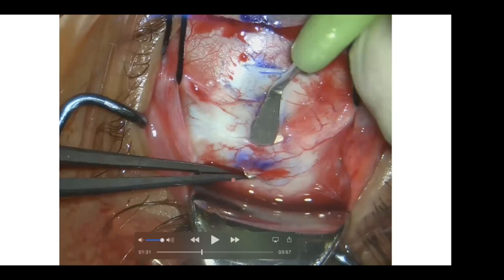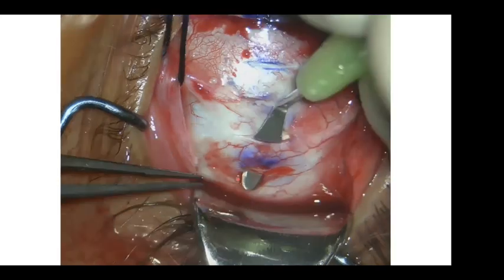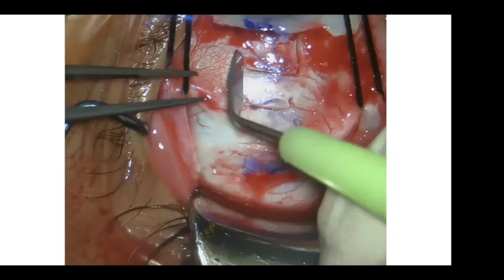And I need a second instrument as a counter pressure, so it's a bimanual technique, because if you dissect the tunnel with the crescent, sometimes it keeps dissecting and it doesn't come out. You want to make the tunnel 3 millimeter as I'm planning, so I use the second instrument to depress the sclera. While depressing the sclera, this will help the crescent to come out. And again, now the crescent has come out, and then I dissect the rest of the tunnels.